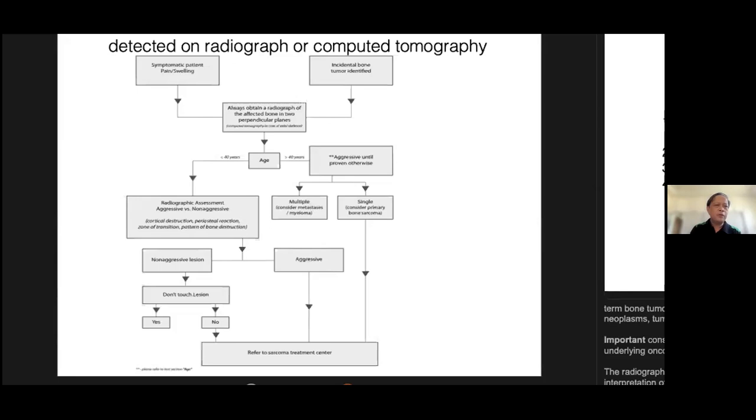So you look at the chart. It basically tells you that the method that you use is called pattern identification. It's a method that will more or less give you a clue of the behavior of a lesion, if it looks very aggressive or less aggressive looking.